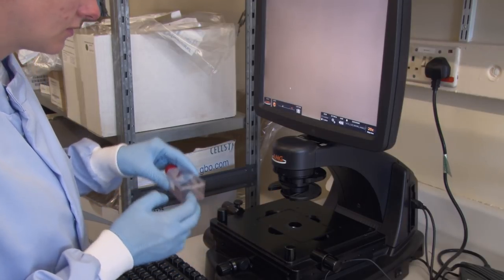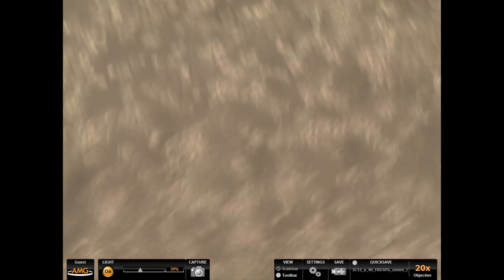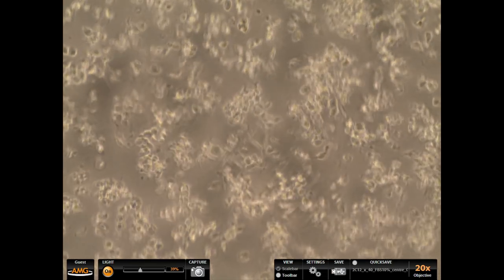Shock the flask by tapping, to dislodge the cells. Examine the cells again to ensure that they're floating free of the plastic.